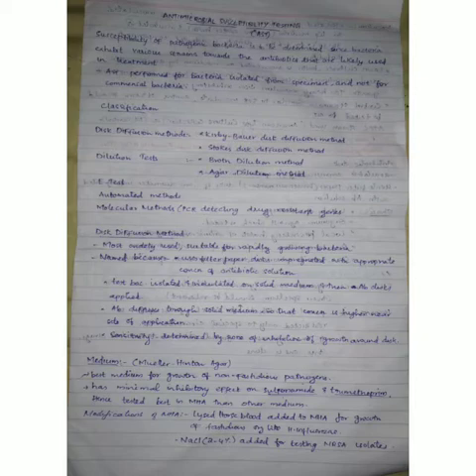Since we use it for non-fastidious pathogens, we have some modifications of MHA also, like lysed horse blood added to the MHA for growth of fastidious organisms like Haemophilus influenzae. We said that this is the best medium for non-fastidious pathogens, but we can also use it for fastidious organisms like Haemophilus influenzae when we modify the MHA. We have another modification, that is sodium chloride. When about 2 to 4% is added, we can use it for testing MRSA isolates. MRSA is methicillin-resistant Staphylococcus aureus.